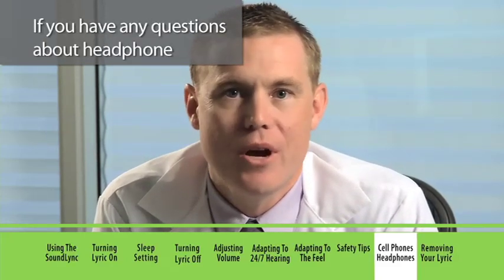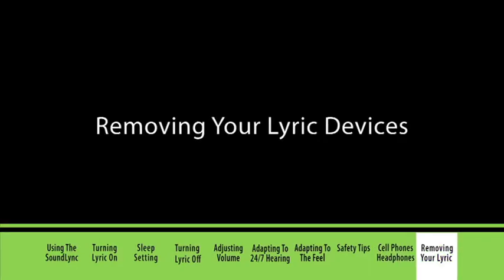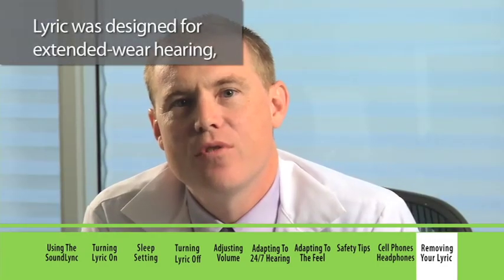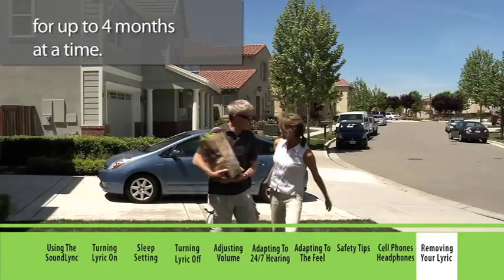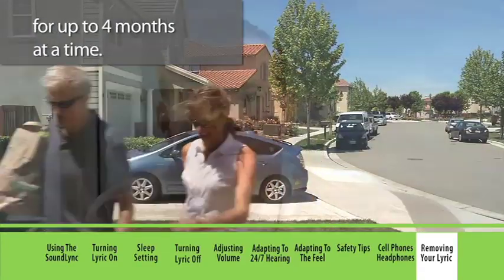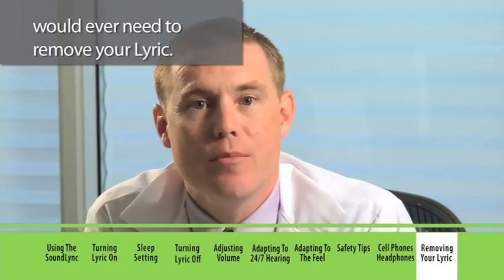If you have any questions about headphone or telephone usage, ask your hearing professional. Lyric was designed for extended wear hearing — 24 hours a day, 7 days a week, for up to 4 months at a time. Since there are no batteries to replace, it is rare that you would ever need to remove your Lyric.